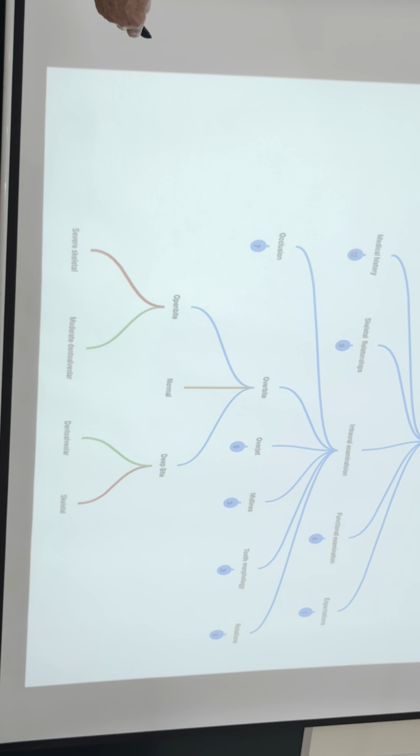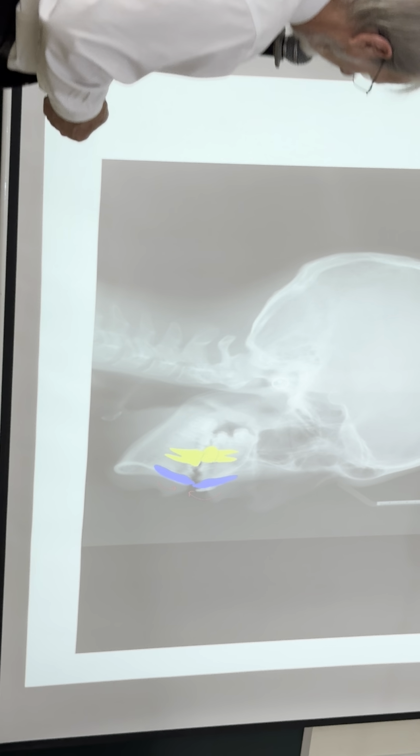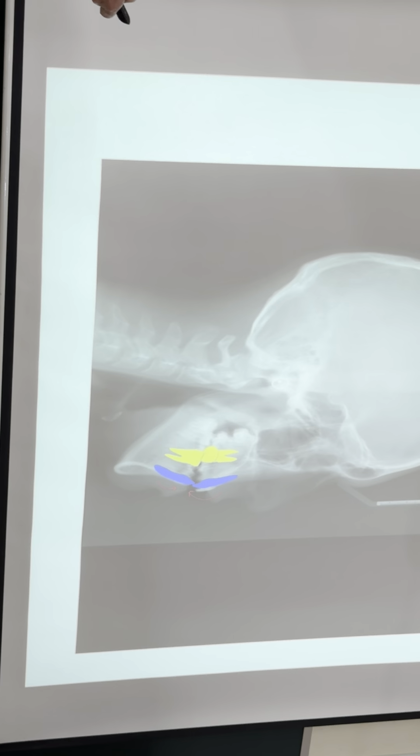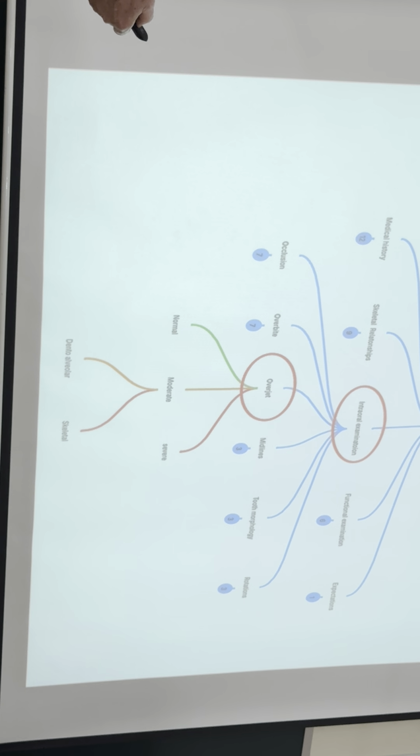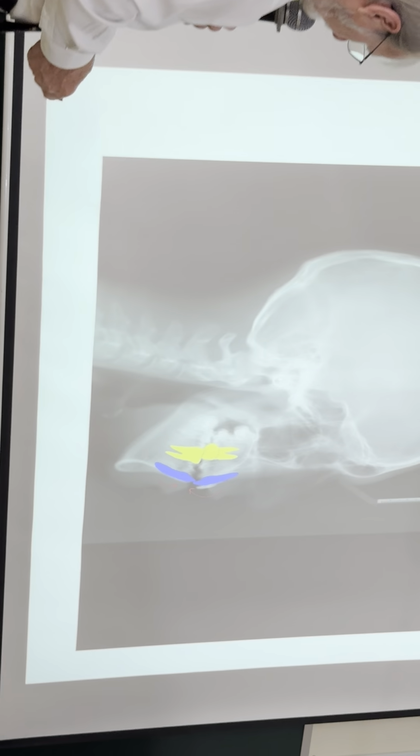Okay, same thing. Patient, control, open bite, normal, dental alveolar, open bite, moderate, fine. So this is the same thing, so we'll pass on that. Okay, so that's the idea. What is the idea? It is to push. Yeah, this is open bite, and all I'm doing is I'm taking the teeth down, I'm taking these up. This is super easy. It looks bad, but it's in reality not that complicated.